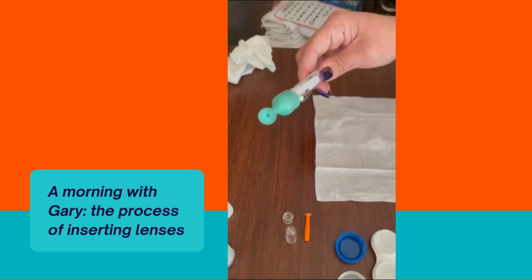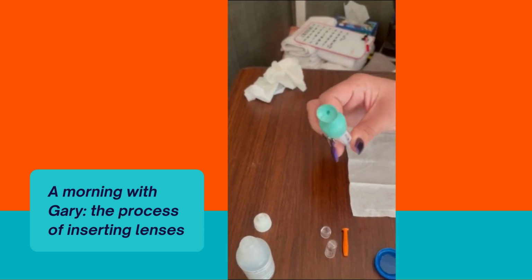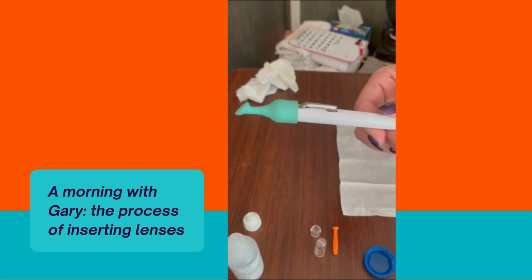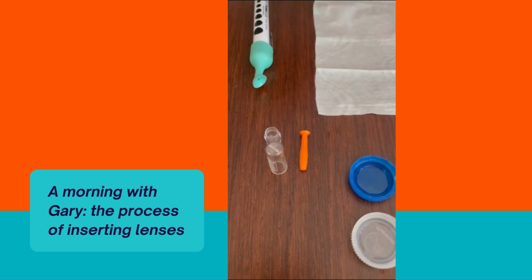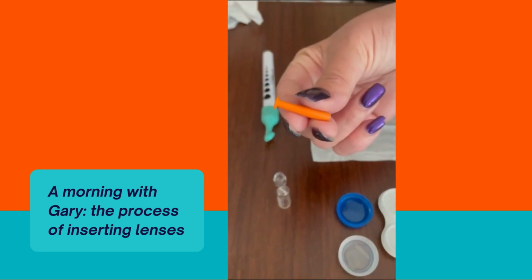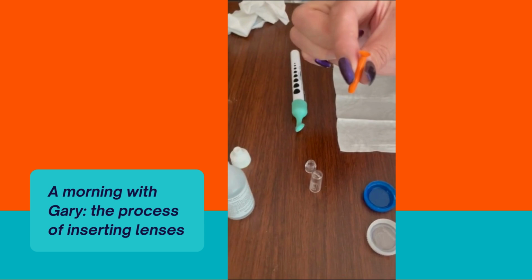So this is a little insertion tool that we're going to use later. It's just a tool we were given at the office, and it's on a little bit of an angle, and it's on the end of a pen light. It'll help flip things in a minute. So we need that. Can we get the little orange plunger? This is the little device we'll use to pull contacts out. So should we need to, this is the way that you get contacts out.